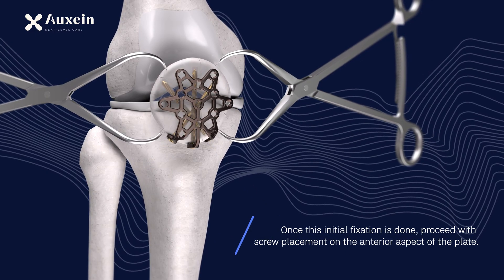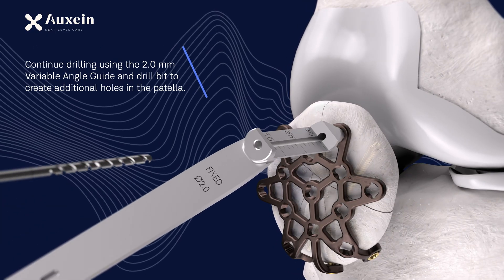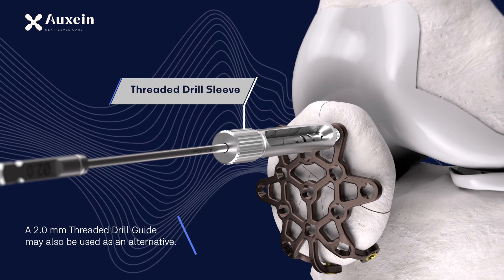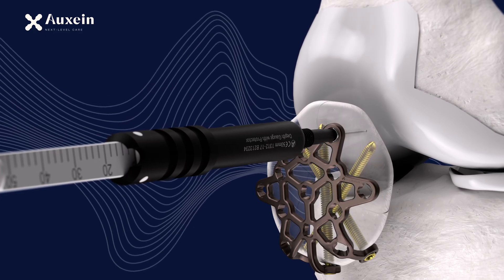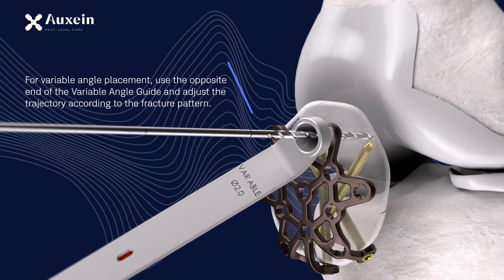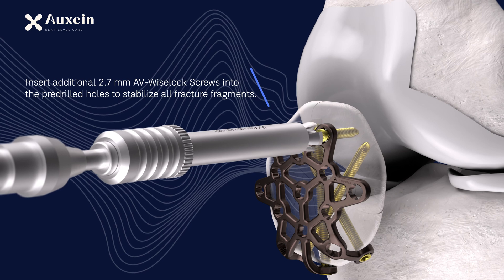Once this initial fixation is done, proceed with screw placement on the anterior aspect of the plate. Continue drilling using the 2.0 mm variable angle guide and drill bit to create additional holes in the patella. A 2.0 mm threaded drill guide may also be used as an alternative. Measure screw length using either the guide scale or a depth gauge. For variable angle placement, use the opposite end of the variable angle guide and adjust the trajectory according to the fracture pattern.